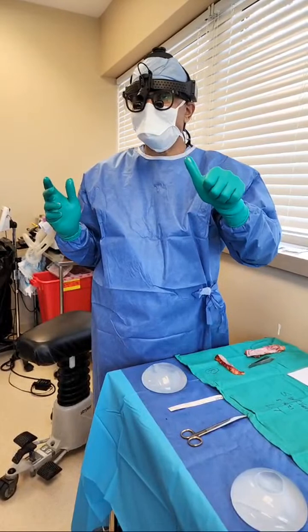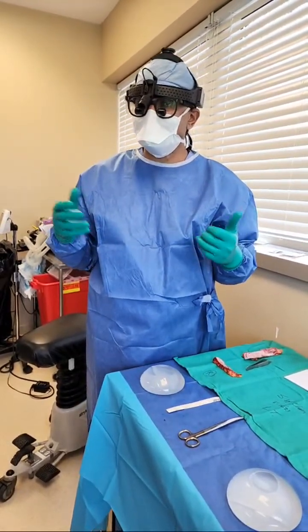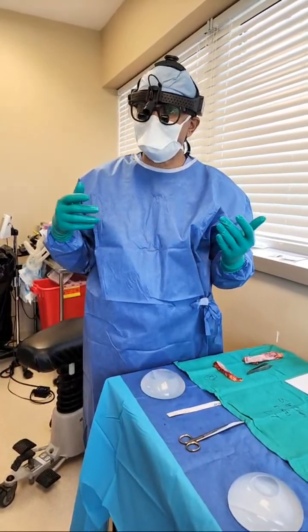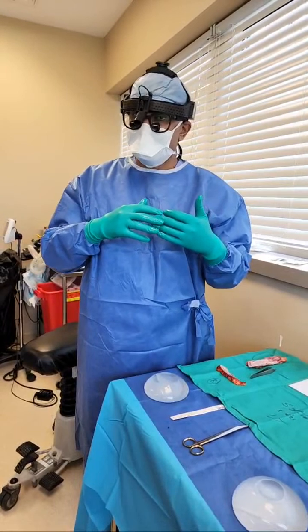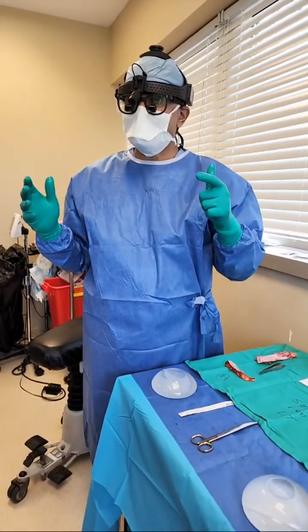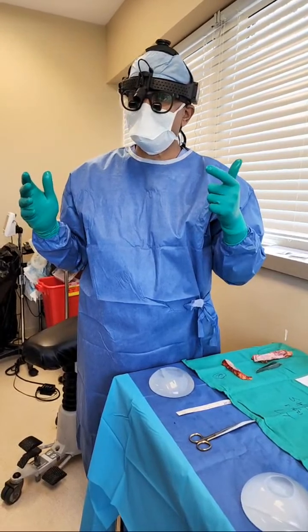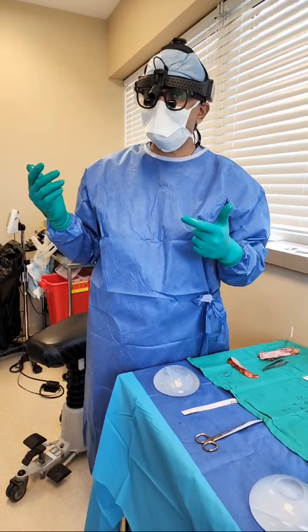The next one is twilight sedation. The patient is comfortably breathing on her own in twilight. To date, not a single patient has recalled or been awake. She is completely amnestic to the event. And the same, I take high definition pictures and videos showing complete removal of the whole capsule.